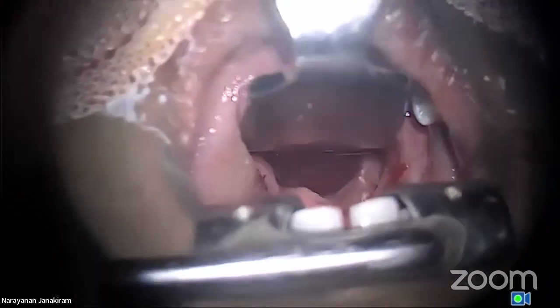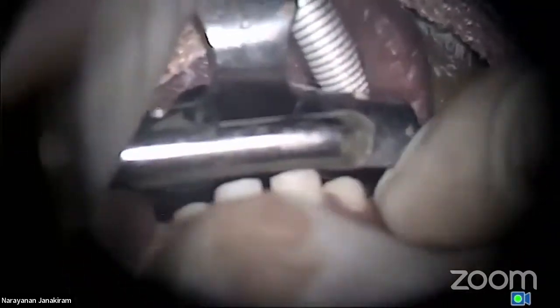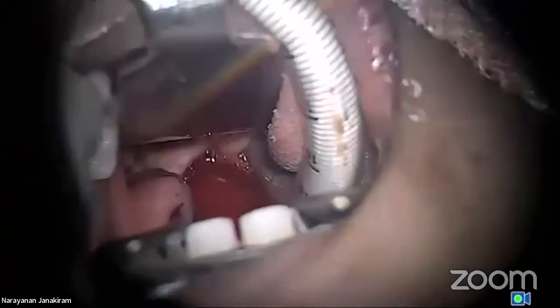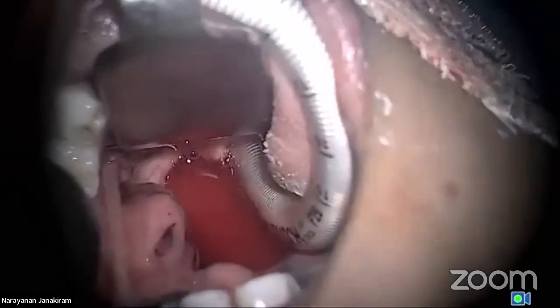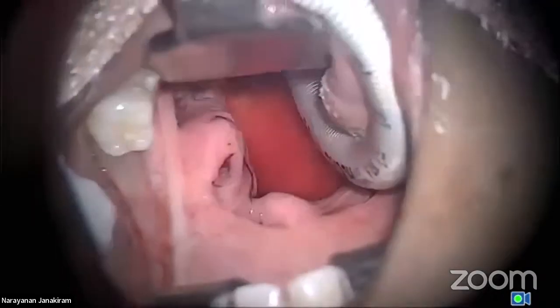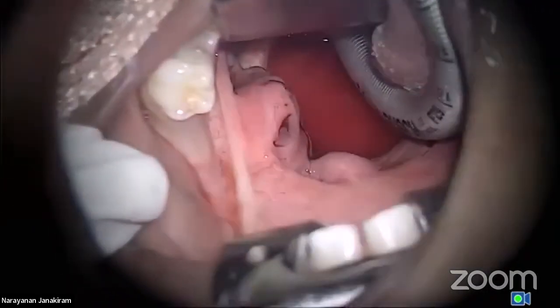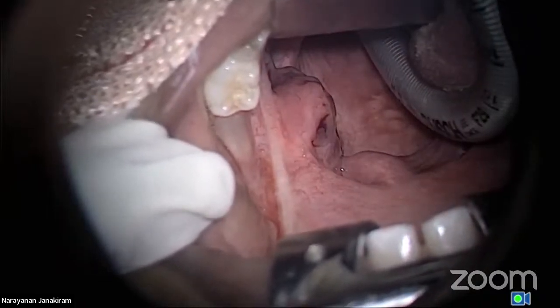So the next one, and you should see that, we don't put the jack. We ask the sister to hold it, if you see the difference. And more importantly, see the exposure we get. Hold. Right. Ready. Okay, right?